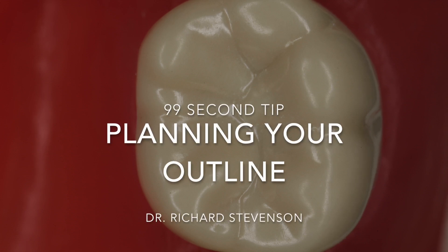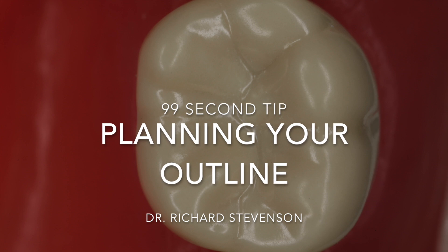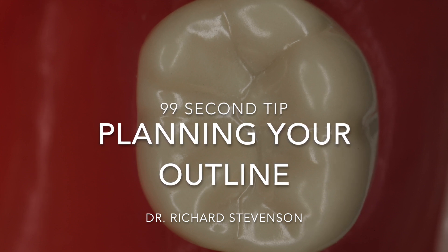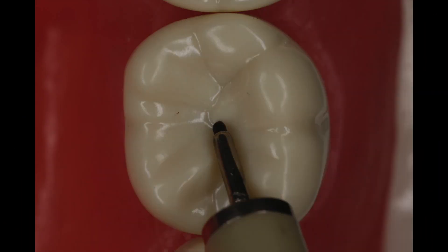Hi everybody, this is another 99 second tip planning your outline form for the class 2 amalgam, and I'm Dr. Stevenson. Let's take a look at a mandibular first molar and decide how we're going to approach this.